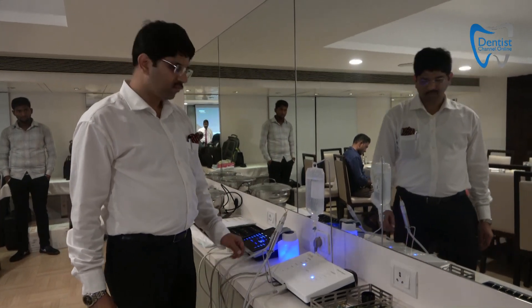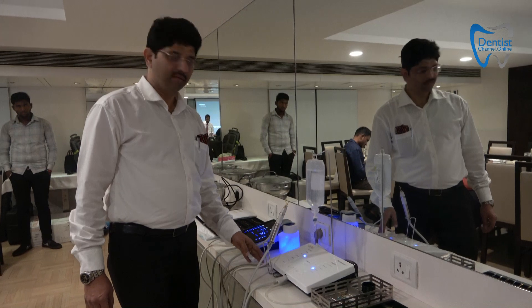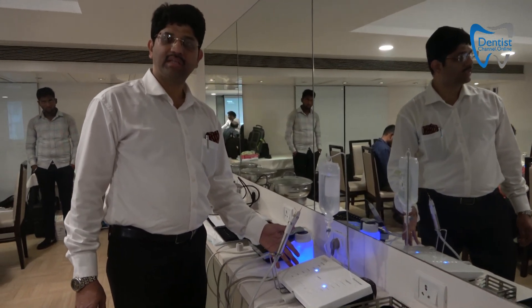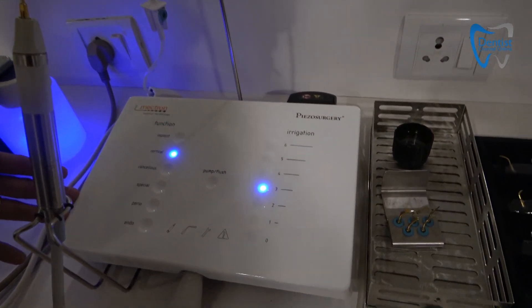My name is Dayas. We are going to introduce to you the Mectron Piezo Surgery White machine, which can do all your cases and is specially designed for dental requirements.